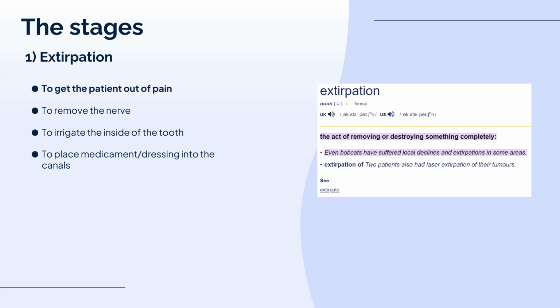So the purpose of extirpation is to get the patient out of pain, to remove any remaining nerve, to irrigate or wash the inside of the tooth, and to place medicaments or dressings into the canals. These are pastes usually.